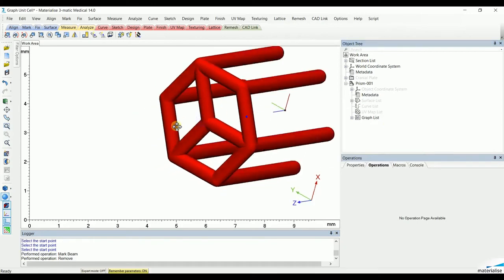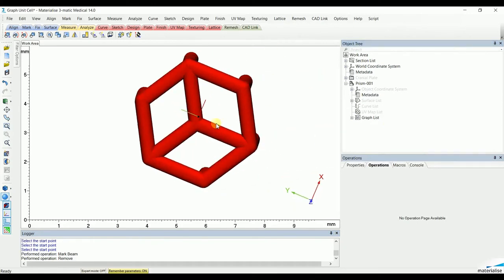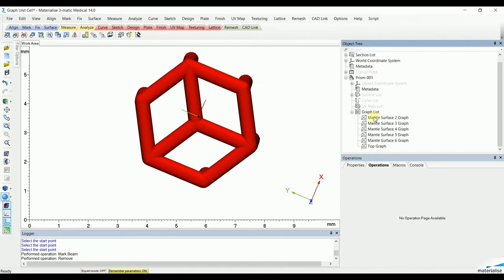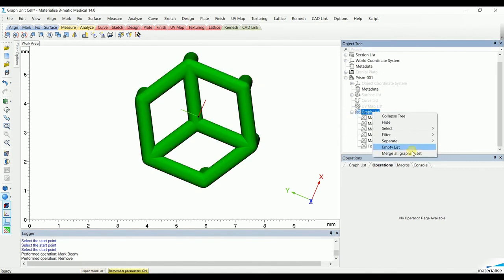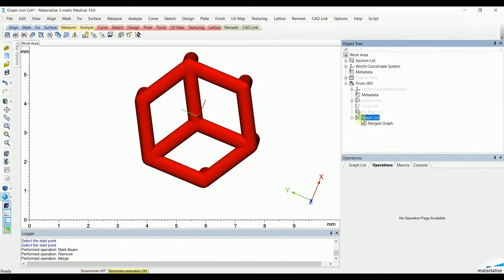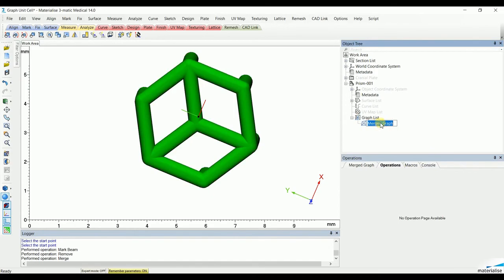The last thing to do is to merge all the different structures under the graph list into one tight unit cell. Let's call it honeycomb.